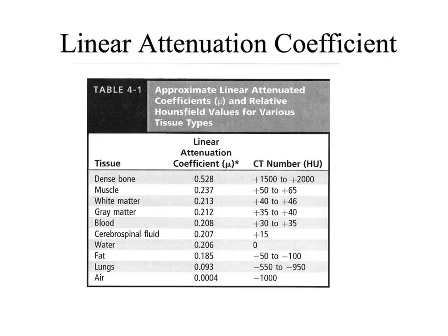Okay, moving along. Here's another way of thinking about it. This is progressing along in our book to table 4.1. This is tying linear attenuation coefficients to what? To Hounsfield units, right? And the importance for that, and what we're going to be talking about in this next lecture, is this is tying the physics of what we know about linear attenuation to instrumentation of how we do this stuff on the computer.